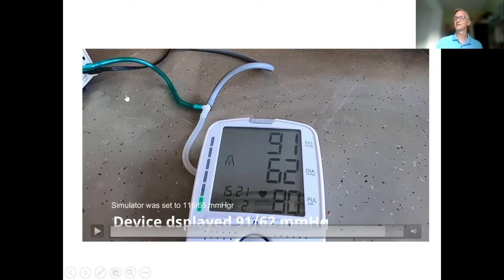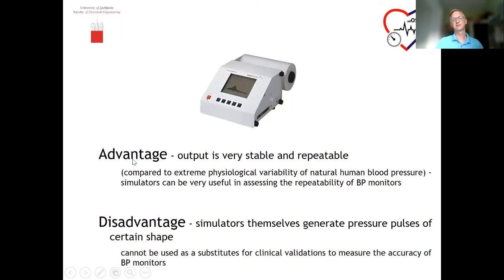And this way of testing incorporates all the errors of the algorithm which is in this device. Okay, so basically the advantage of every simulator is that they are electromechanical devices and they are extremely stable and repeatable as compared to the extremely variable physiological blood pressure.